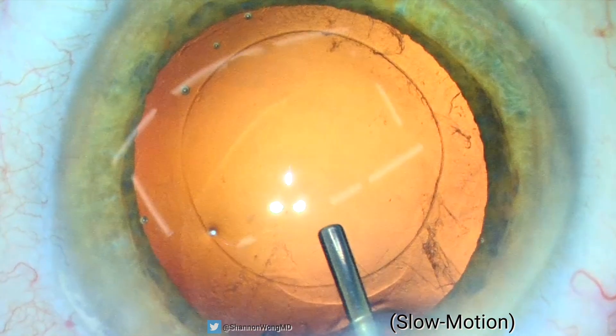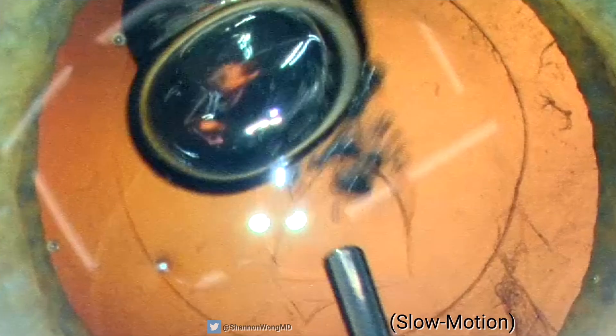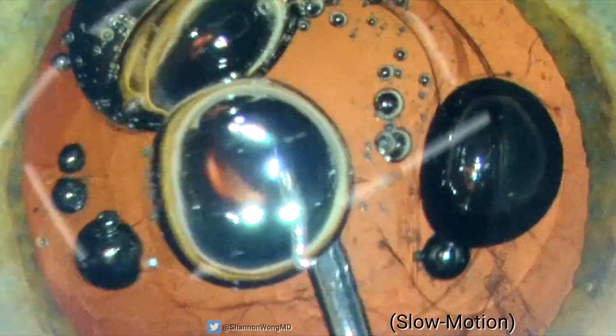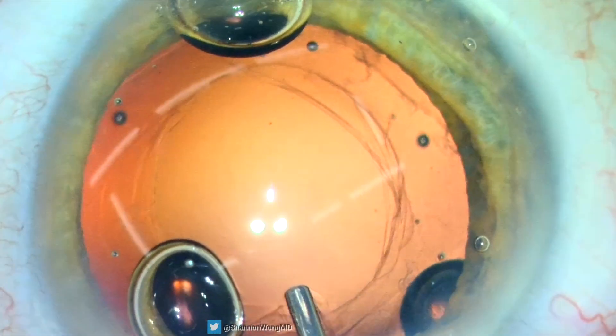The viscoelastic is gently infused into a normal capsular bag, and boom — there we can see it clear as day: an opening in the posterior capsule created by the viscoelastic or the viscoelastic bubbles. We identify the issue and can see that the posterior capsule rupture has extended.